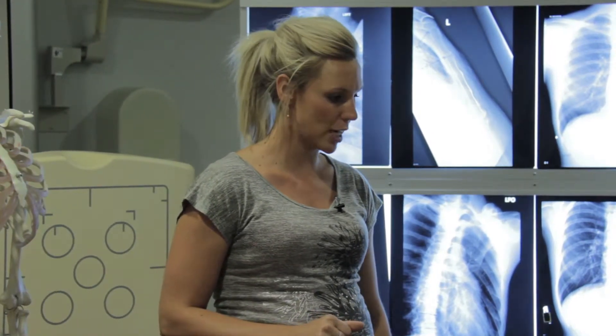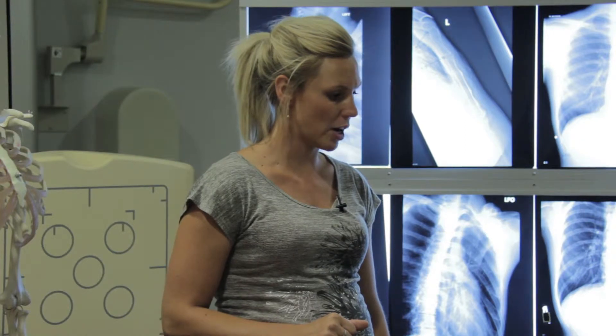On to protocols. We're going to start with the upper ribs — they are kind of the foundation for the rib series. No matter where the pain is, where you put your BB, you will always do these first four pictures. Even if they're having severe lower rib pain, way down almost on the hip, you will still do upper ribs. You will always do these four pictures; these are the foundation of the series.